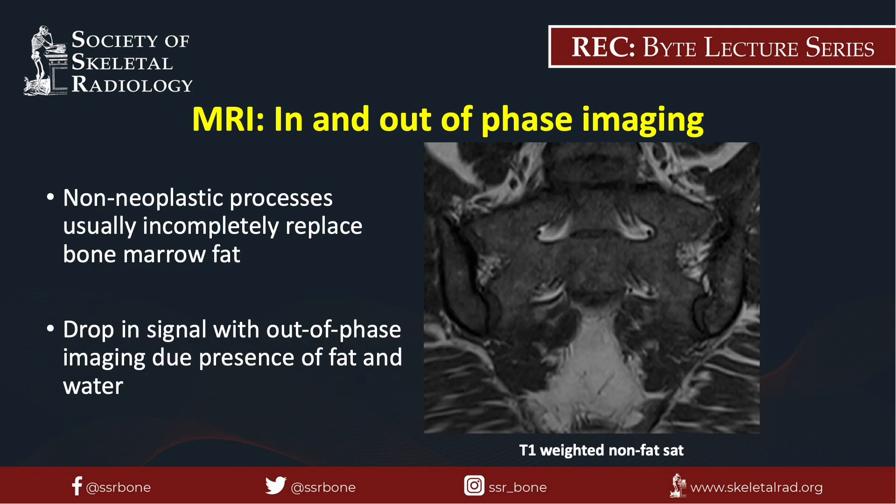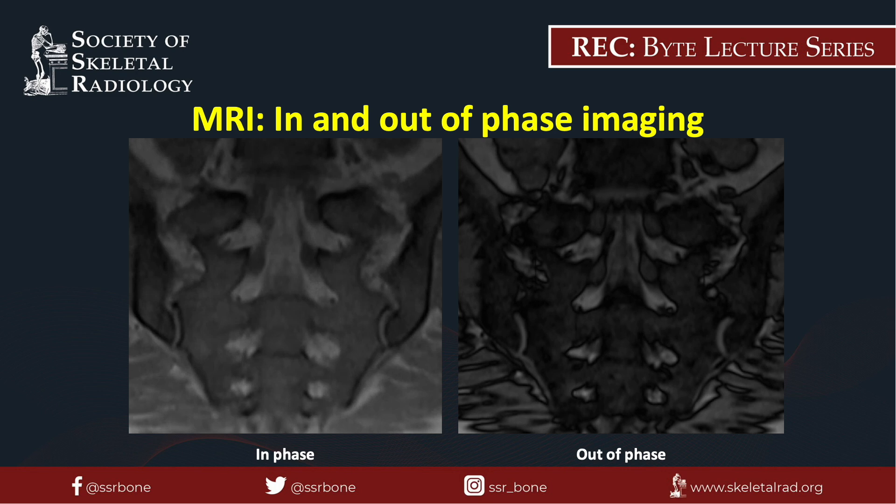In this MRI of the sacrum, the bone marrow is diffusely heterogeneous on a T1-weighted image and appears isointense to muscles, which may suggest red marrow reconversion or a pathologic bone marrow replacement process. There is a clear drop of signal on the out-of-phase image relative to the in-phase image, confirming the presence of intravoxel fat. As such, this patient likely has pronounced red marrow.